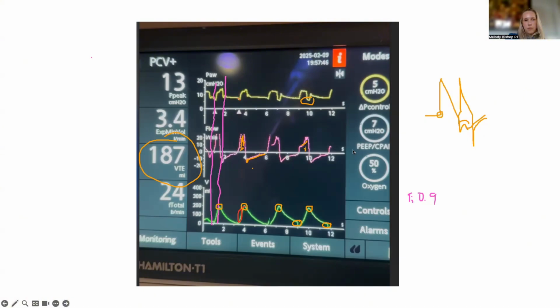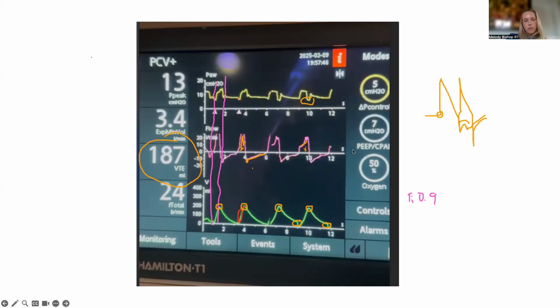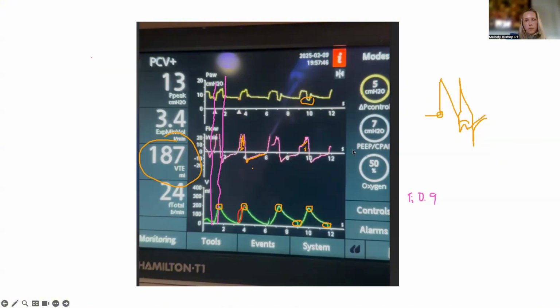So unfortunately, with this situation, it's a little bit different because if you can lighten the sedation, as you mentioned, that is one way to get rid of it. It's based on this neurologic, I don't want to call it a theory because it's been proven, called entrainment, which is the body reacting to its outside environment patterns. So if the brain is entrained, you can have 3-to-1 reverse triggering, 2-to-1, 1-to-1, meaning every breath is a reverse trigger. You could have it patterned 2-to-1, so every other one's a reverse trigger. You can have 3-to-1, every two breaths, that third one is a reverse trigger. So it's actually more in depth, and there's some papers on it. I could probably link to this as well because it's very interesting.